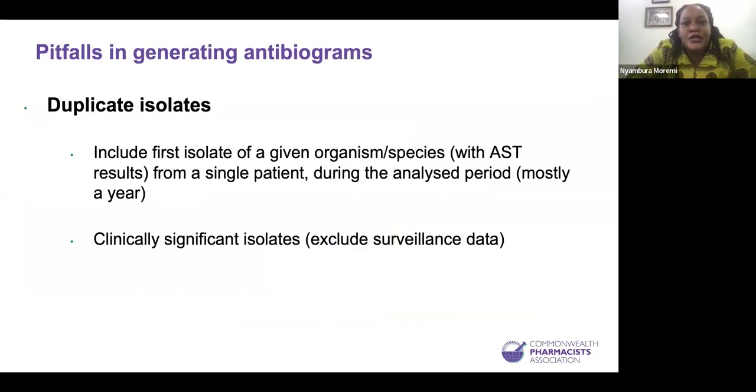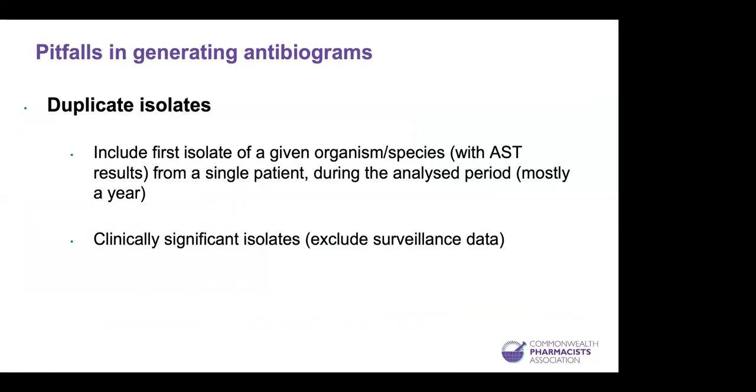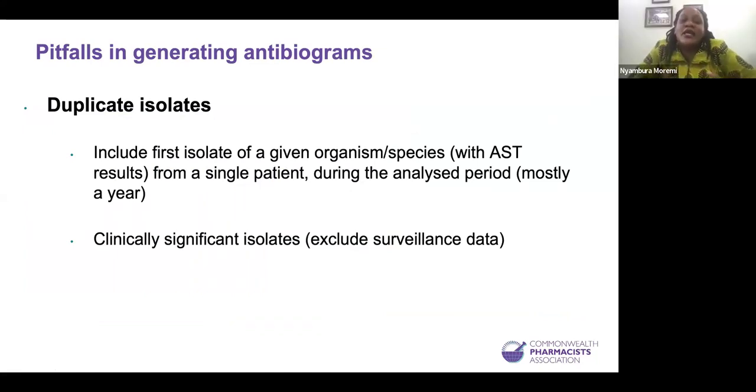So we want to quickly go through some pitfalls that we usually make when we create these antibiograms. One of them is, you find that you have the results for the whole 1 year, for instance, and you want to analyze isolates from urine samples. But you need to take into consideration the data that will give you statistical meaning.